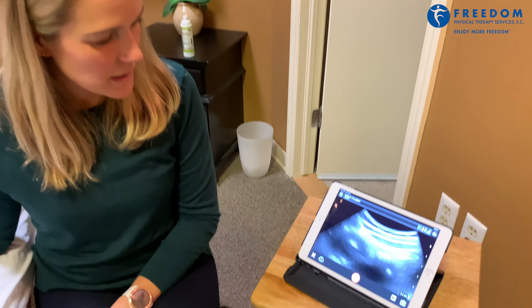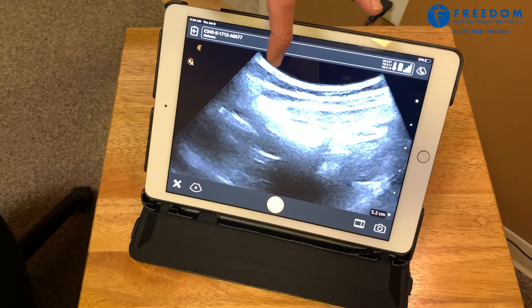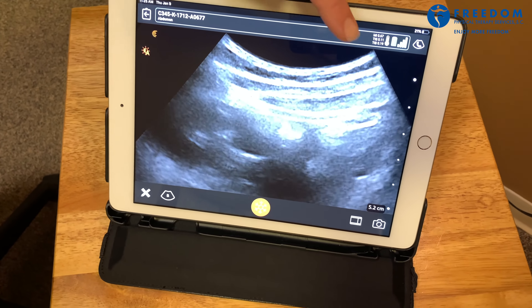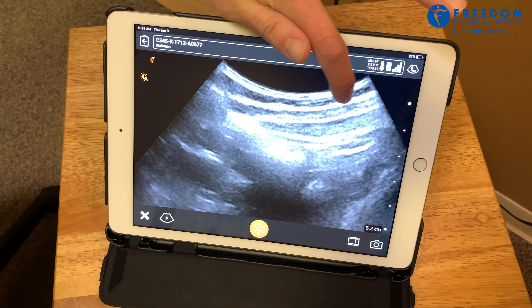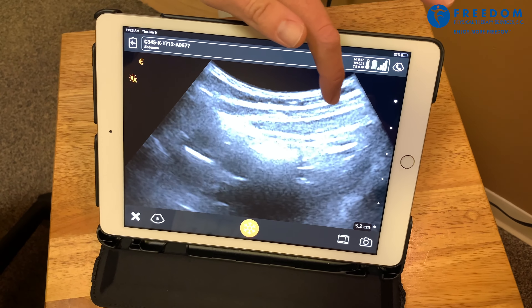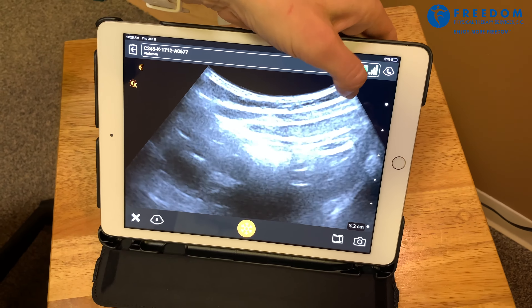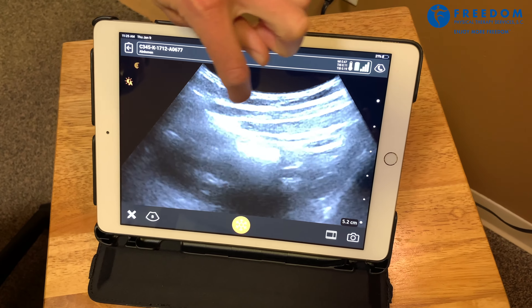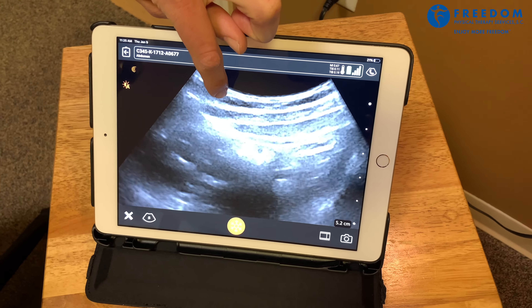I'm going to show you a picture here. We're looking at these white lines and dark spots separated. The very top white line is skin, and then this black part in between is just subcutaneous tissue. Now we're looking at the second white line, and that is separating out our first of three abdominal muscles we can see.